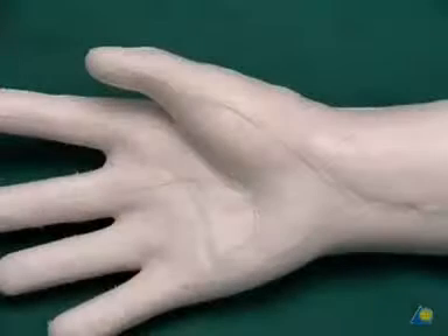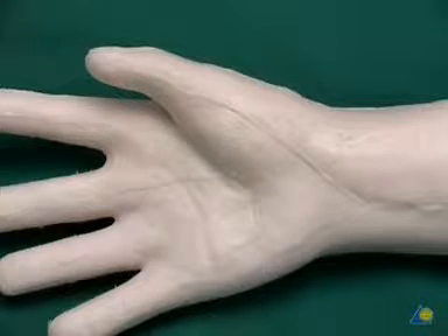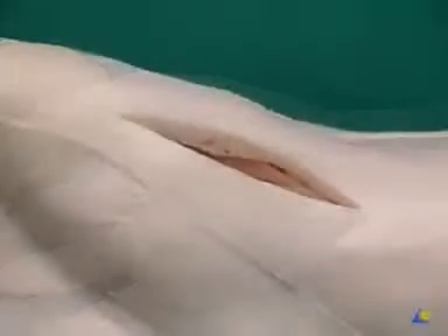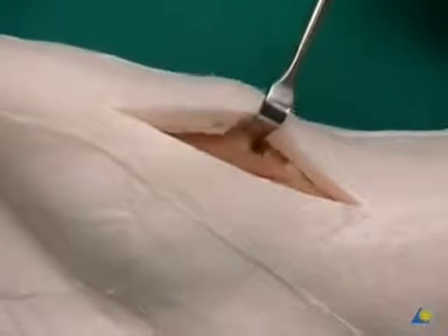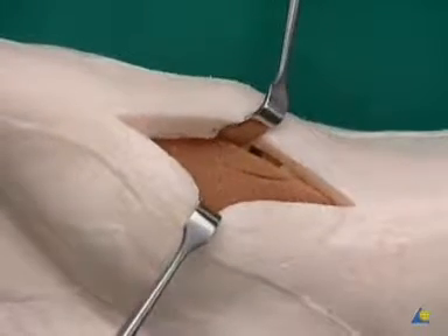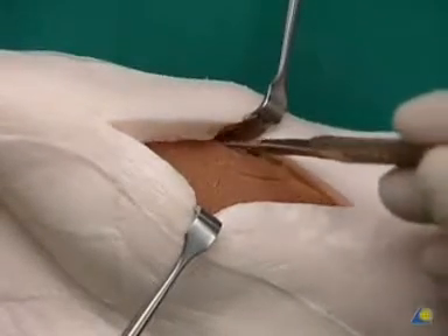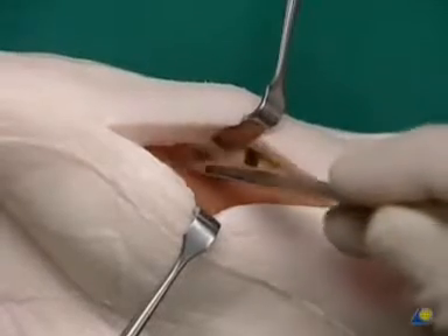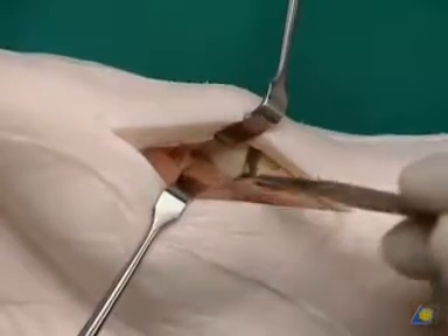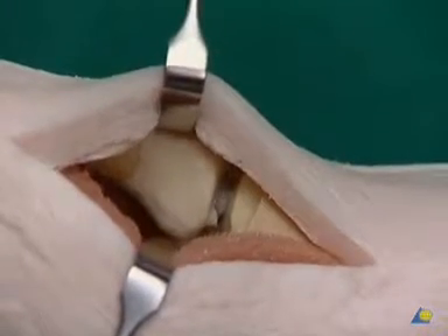The approach is marked on the model and the longitudinal incision is performed as planned. Blunt hooks are used to spread the soft tissue mantle apart. The thenar musculature is removed with a scalpel in the palmar direction. After repositioning the hook, the base of metacarpal one becomes visible, providing a good view of the base and the saddle joint.